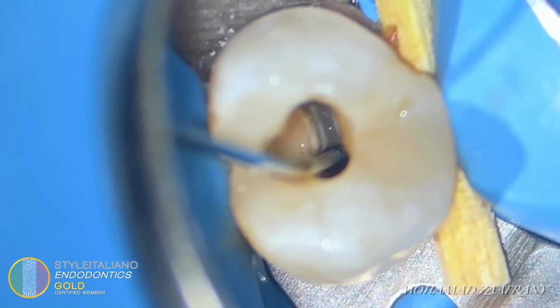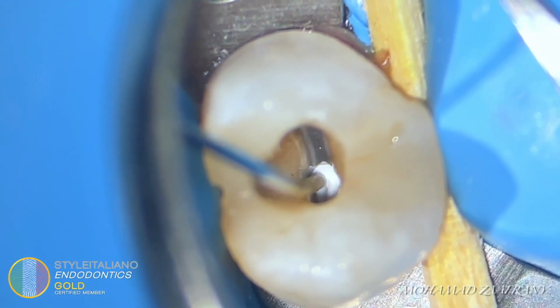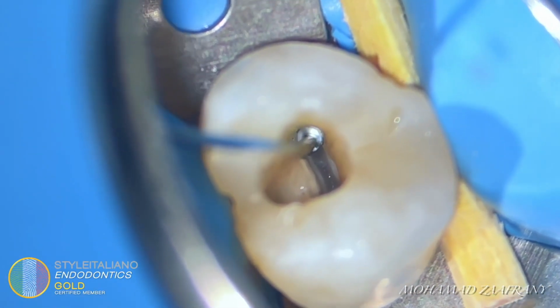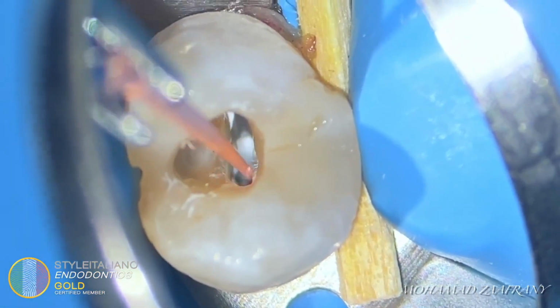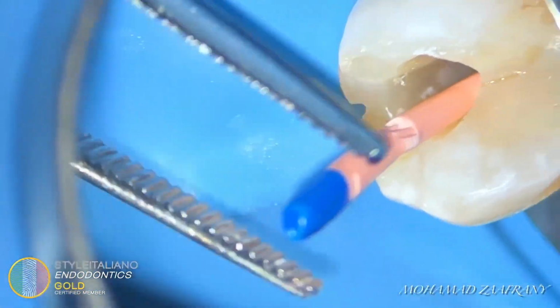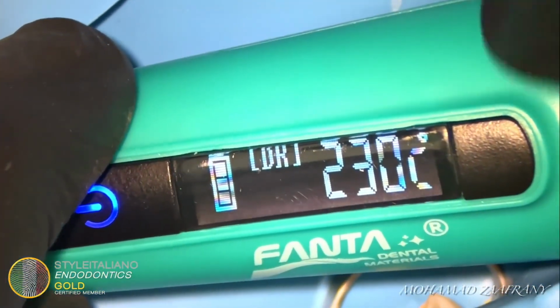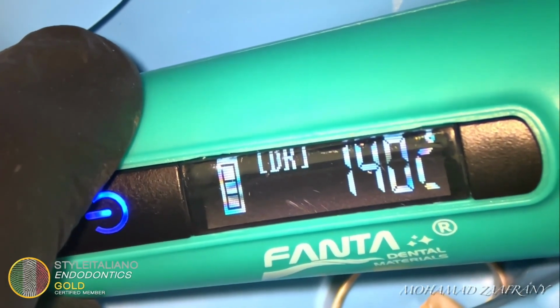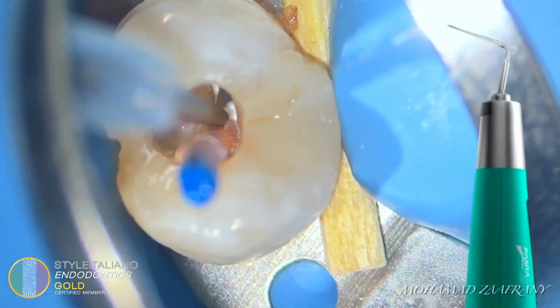I am injecting bioceramic sealer into the canal, the palatal canal, the buccal canal. Here is the master cone after proper selection, confirming it's reaching the working length. Now I need to decrease the temperature to 130 degrees to avoid overheating inside the canal, not to affect the properties of the bioceramic sealer. This is a modified heat technique.